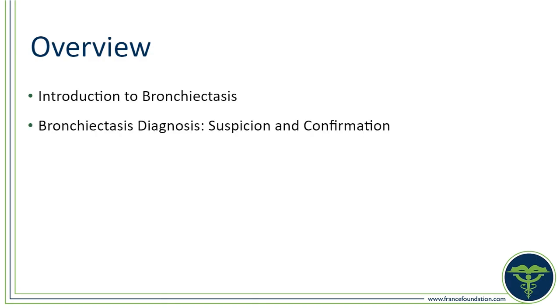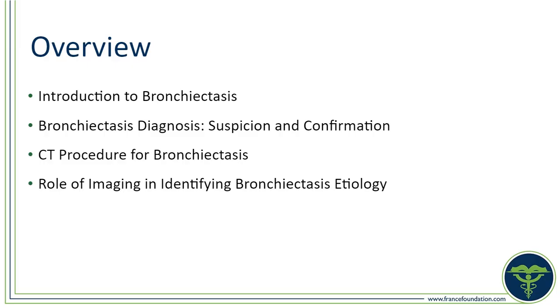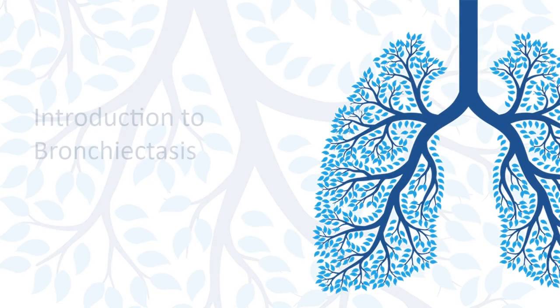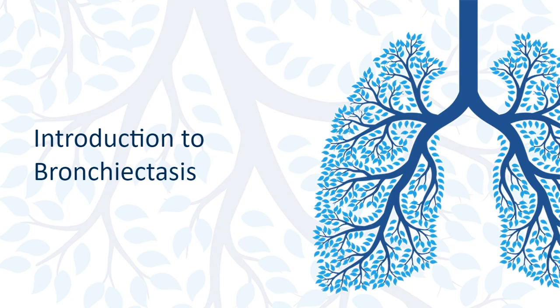An overview of this lecture will include an introduction to bronchiectasis, bronchiectasis diagnosis, suspicion and confirmation, CT procedure for bronchiectasis, role of imaging in identifying bronchiectasis etiology, role of imaging in bronchiectasis after diagnosis, and a case presentation. We will begin with an introduction to bronchiectasis.